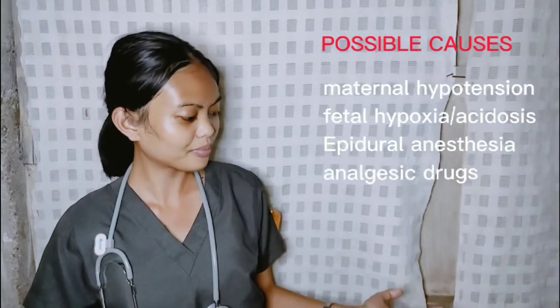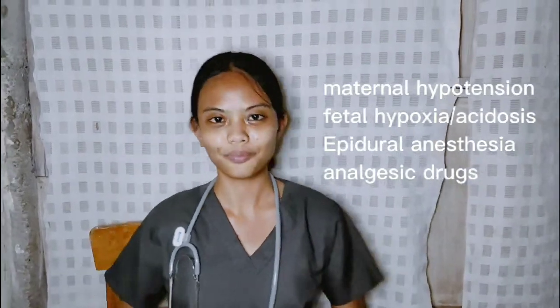And if it's outside and lower than the normal baseline, or it is less than 110 beats per minute, it is called fetal bradycardia. And it is called indeterminate. The fetal heart rate is called indeterminate if the baseline is present for less than 2 minutes.